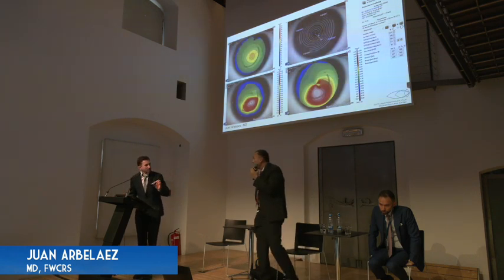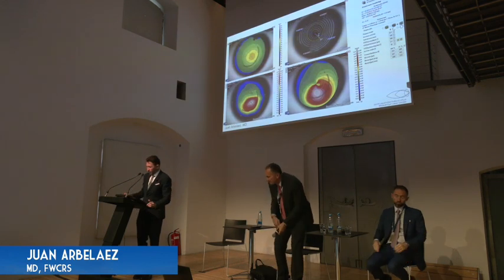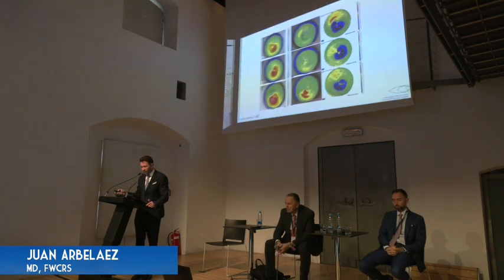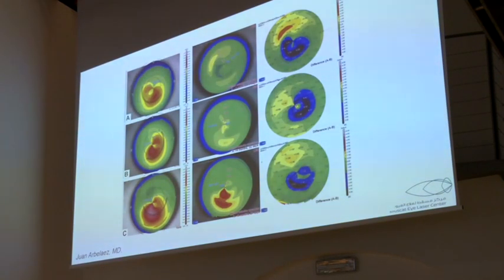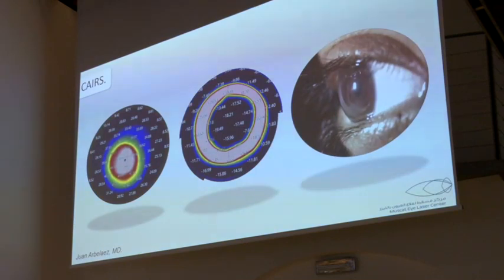I'm about to finish? Okay. So here is, similarly, we can see also the differential maps, the preoperative scans in the left, in the middle, the post-op, and the differential maps. And it's also helpful to measure the results in the patients when we do implant rings.